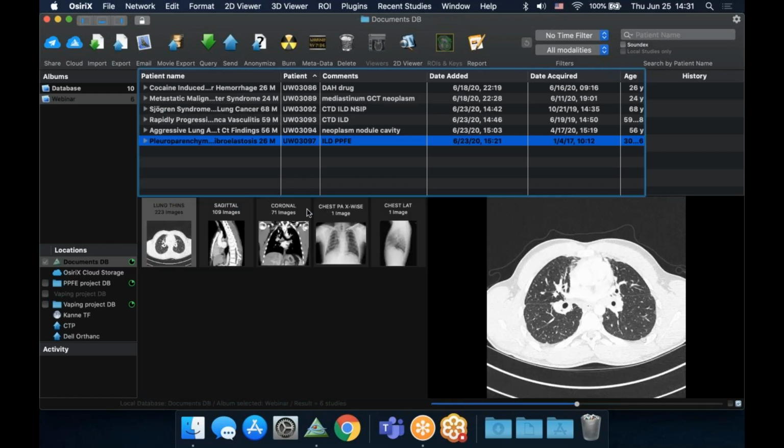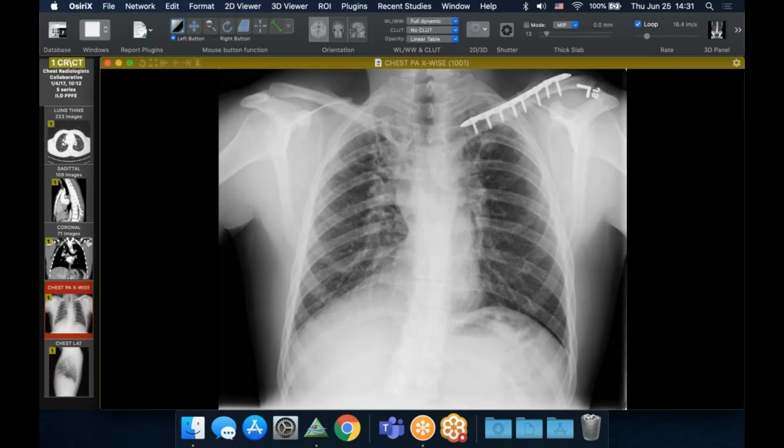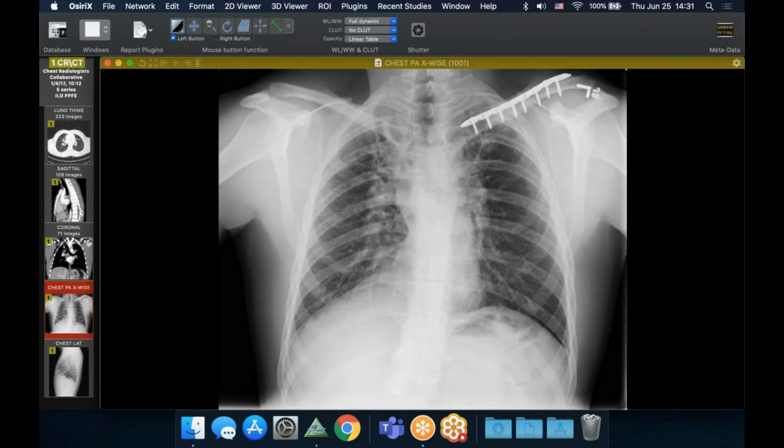This is just a classic case. I came across this case because this patient's got a lung transplant, but this was an older radiograph, and you can see there's biapical thickening, some old trauma. But more importantly, I think you'll notice the hila are really distorted. It almost looks like an old Hodgkin lymphoma mantle radiation appearance, but that's not the case.